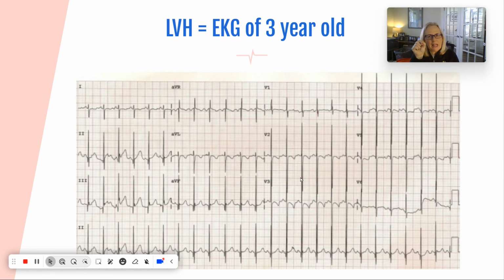It's very, very thin. You can barely see the QRS points, whether it be QRS. They're right next to each other. They're so small, so thin. Very tall, very skinny, okay?